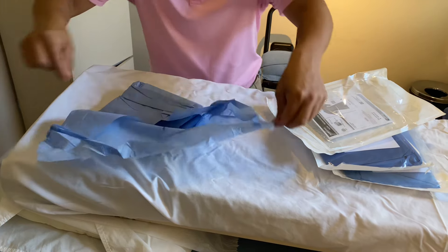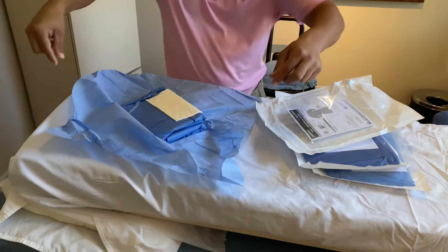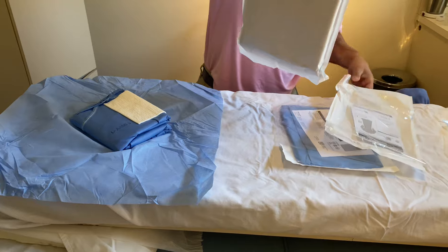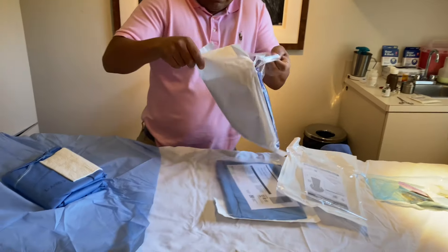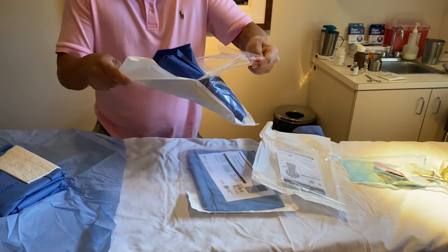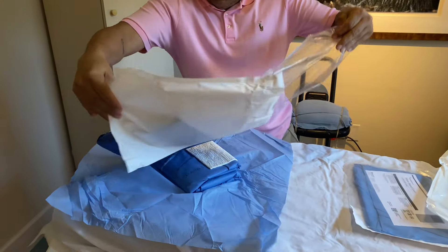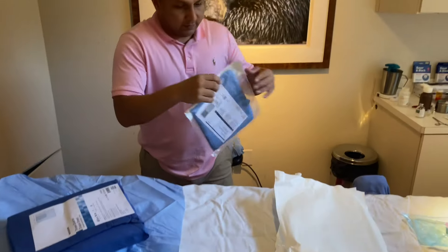I'm only contaminated in the corners — you can see the corners right there. You still have a nice sterile field. The only thing that's been contaminated is the corners. And then you'll open up the three-quarter drape, still in the sterile field, nothing's been contaminated.